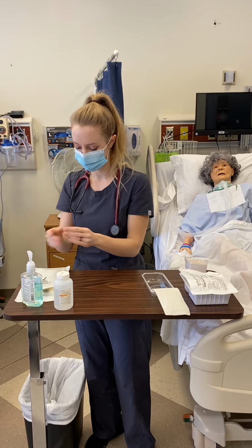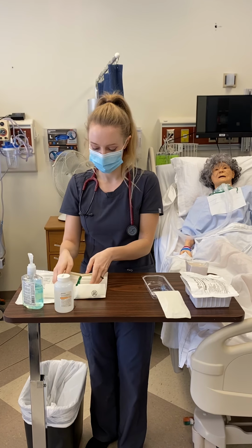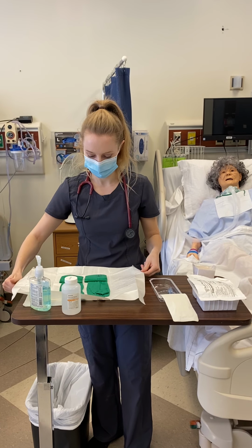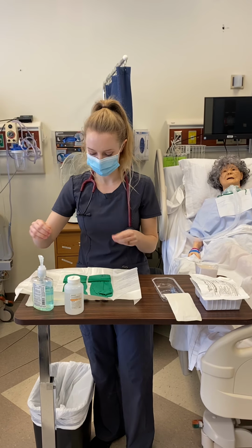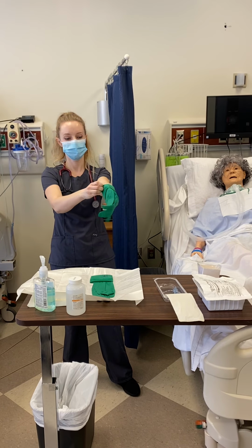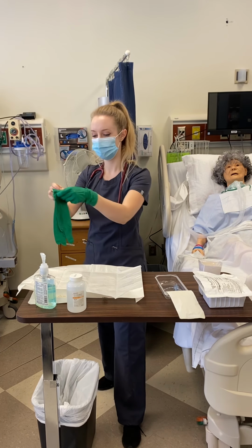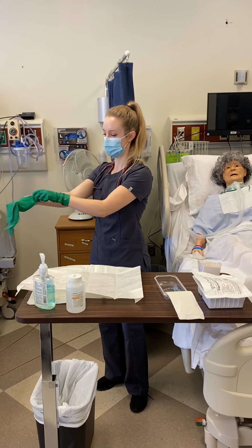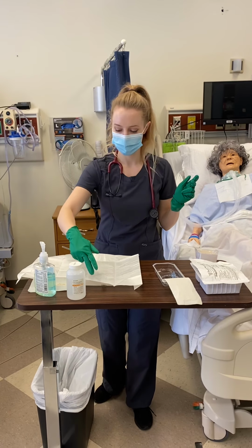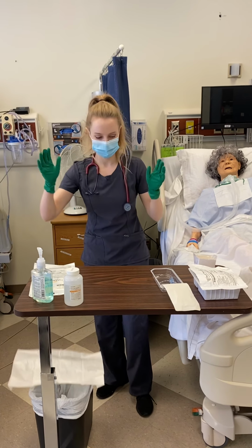Hand hygiene, and I will don my sterile gloves. I can get rid of my wrapper for them.